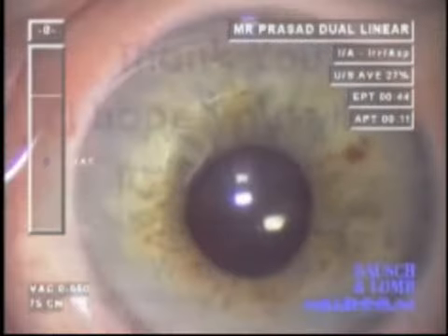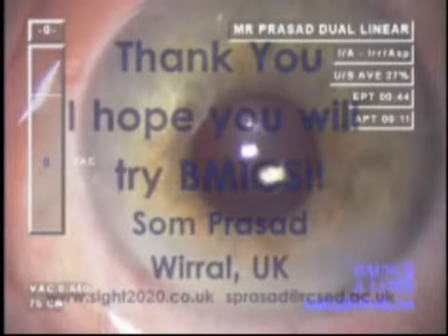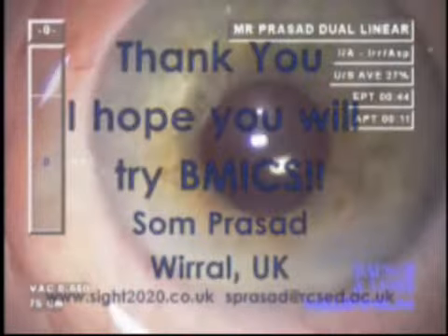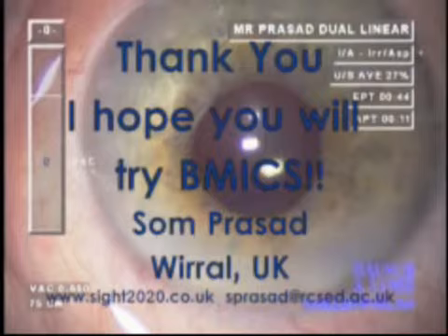I hope you will all consider bimanual MICS to be an option in cases which can be challenging, such as this case with a small pupil, Flomax use, and high hypermetropia.